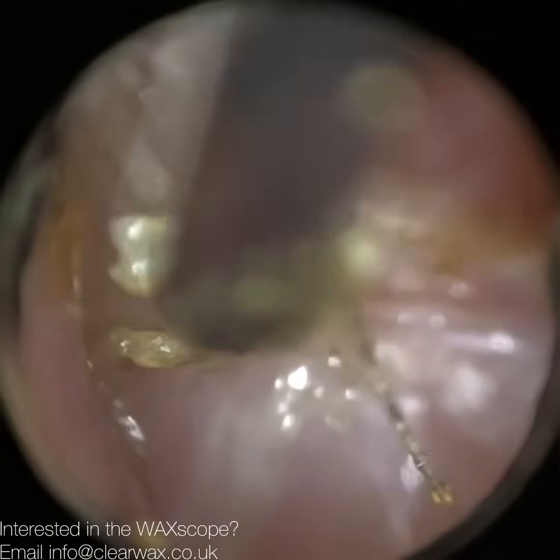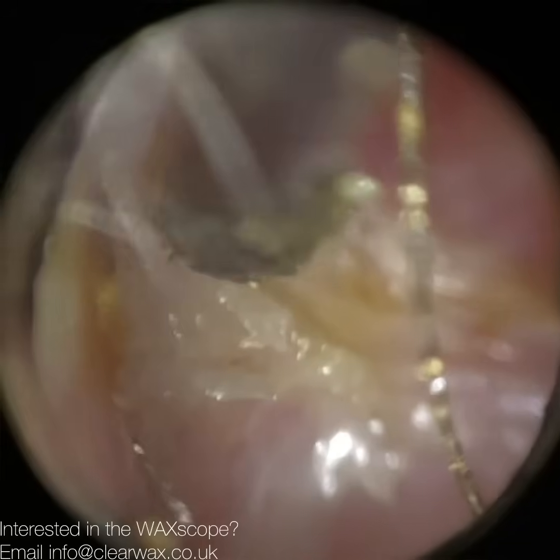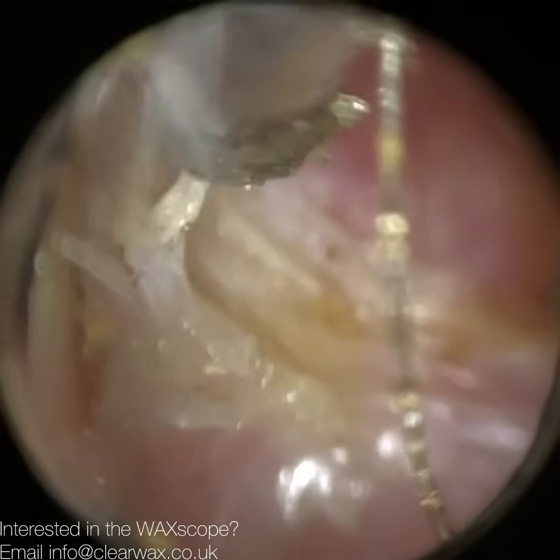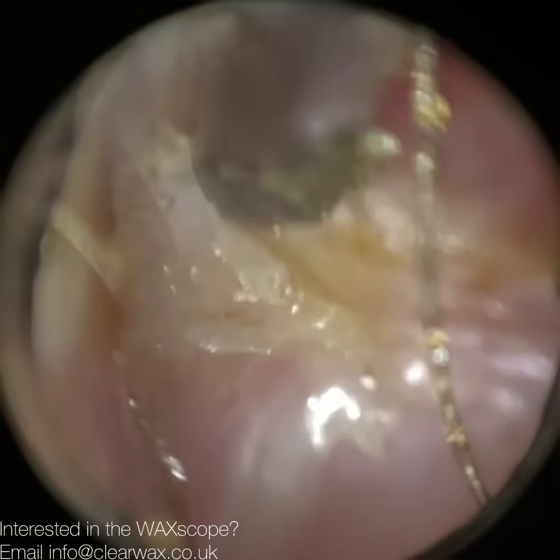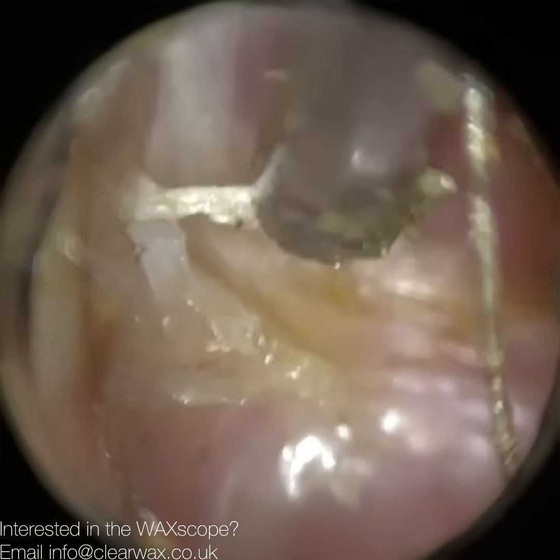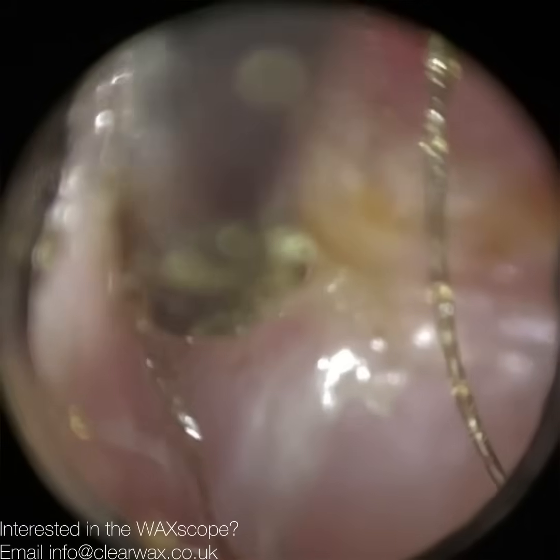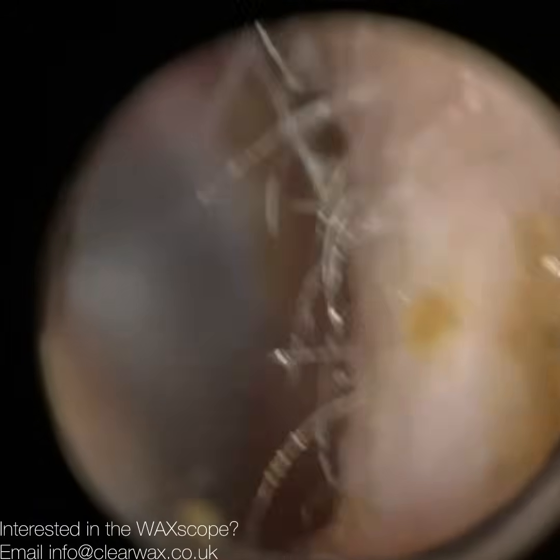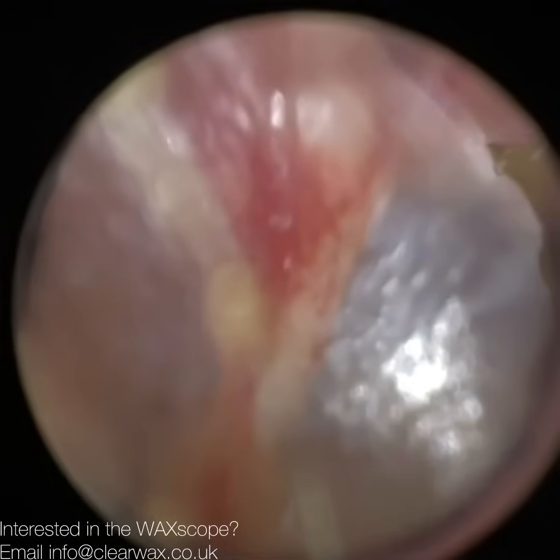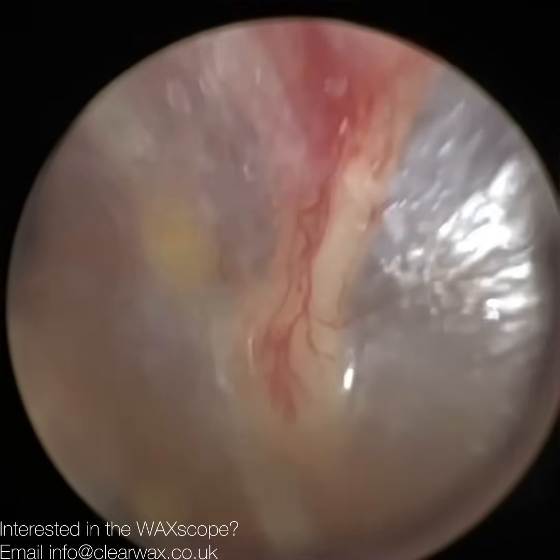So you can see here, this is like the cliff edge. Where I'm peeling this skin away, this is where the bony part of the ear canal is still present, and then you get this sudden cliff edge. So this skin is trying to migrate out of the ear, but it doesn't know where to go because there's no more bone in front of it. Instead, there's this ditch, this pothole. So that will eventually fall into that well, that crater, and form into a wax and keratin plug, which will really need removing on a regular basis. So I advise the patient to come back every 12 months.